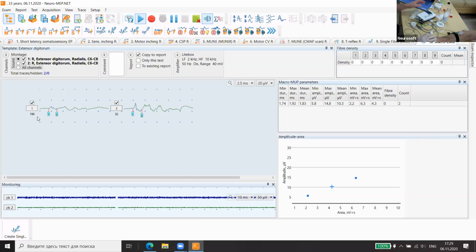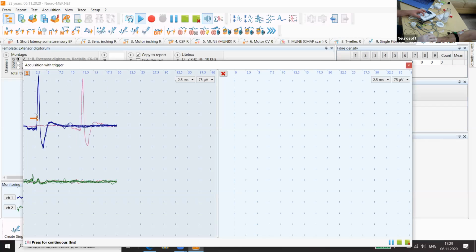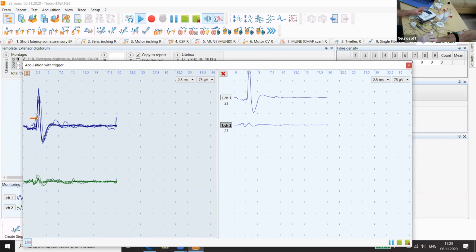It's a very nice move. Contract, please. Some lower, stable. Yes. It's better than the previous.